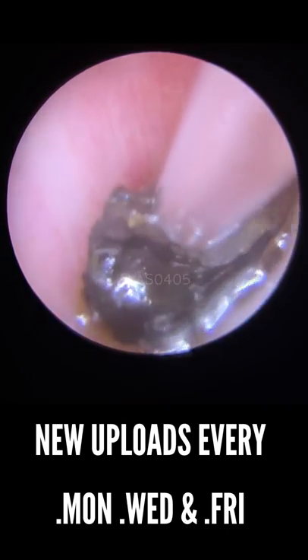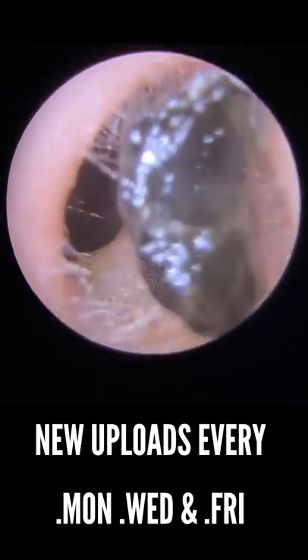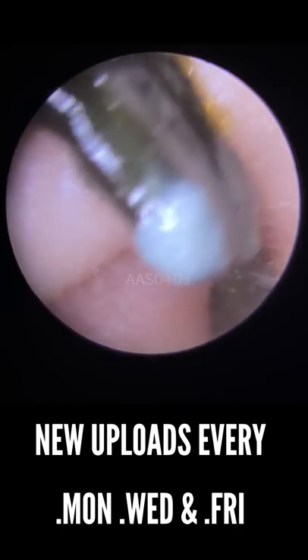There we are. You can see this just sliding down the ear canal because we put the olive oil in — it slid really well down the canal. This little piece here was as hard as stone.